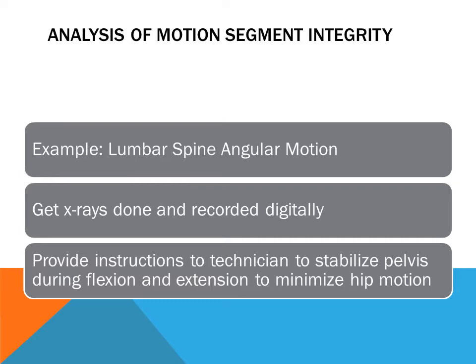And it's also important to note that you may have a deposition on this particular patient, and you may be asked in the future, well, what did the studies show? Or you may be asked to demonstrate how you came up with your conclusion that there was a loss of motion segment integrity, or that there was a spinal anomaly, or whatever. I'm just using this as an example. And the images upon which you rely have to be perfect. Insist on perfect images. So get them done at a local facility where they have million-dollar equipment and everything's digital.